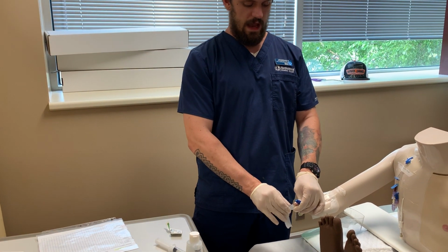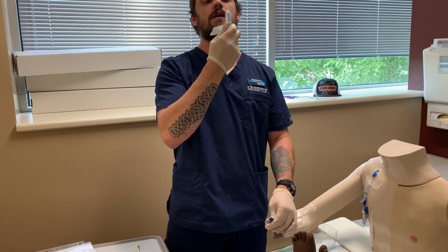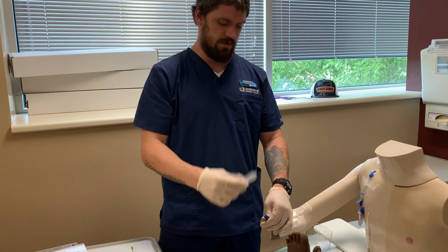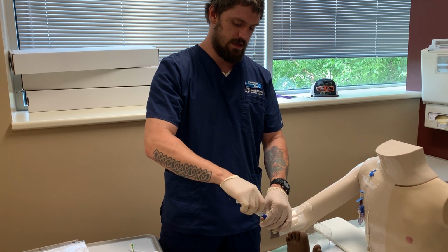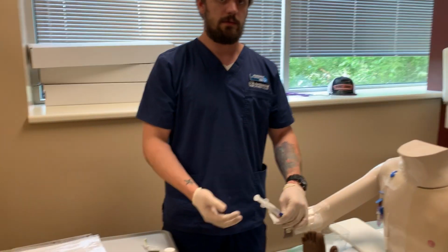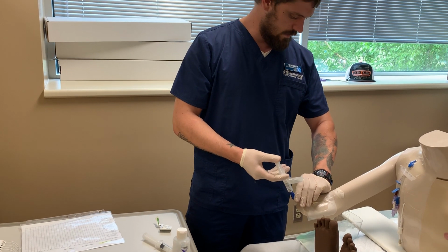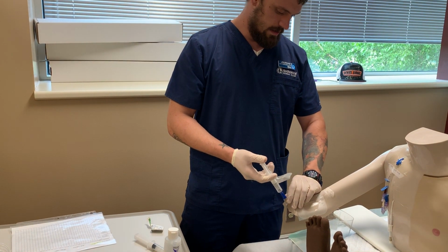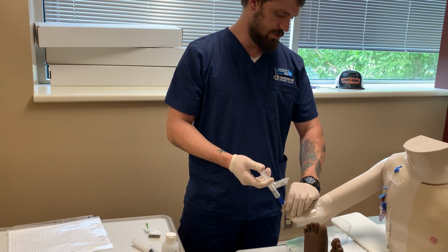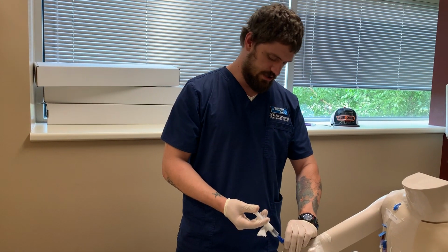All right, Miss Doe, I want you to let me know if at any point during the administration of this med you begin to feel nauseous, the need to vomit, or you start to feel like you're coming in and out, anything like that. You start to feel like you're having trouble breathing, okay? Okay. Awesome. So we are administering this over 5 minutes. I'm going to note the start time and begin our push. I'm clamping it, of course, beginning our push. And I'm going to speed things up just for the sake of the demonstration.